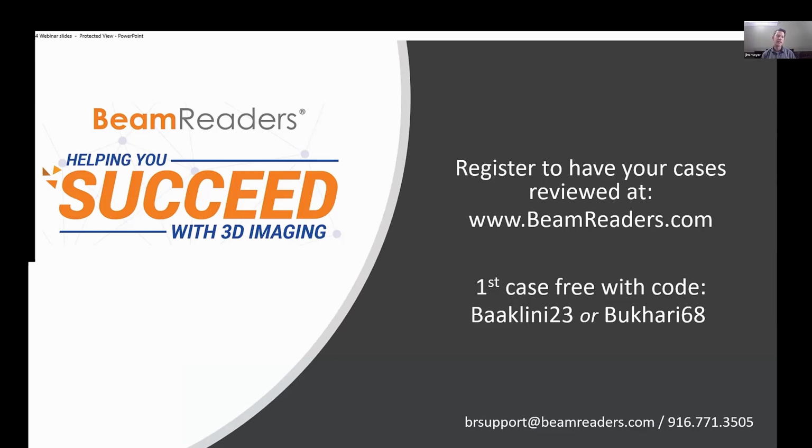Talked about describing borders, density, internal content, a lot of terminology, analyzing the patterns of bone and understanding the impact on surrounding structures. Dr. Boccolini, you took us through some cases to show that and some screenshots, and Dr. Bukhari, you did the same thing. And then the radiology review and best practices of what we're seeing and what we can expect from the objectives and learning on there. So I want to thank you both for the time.